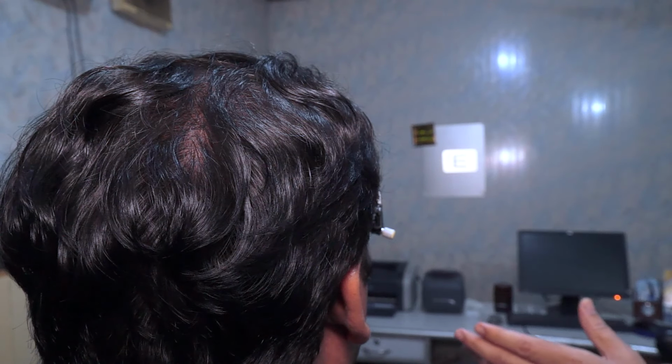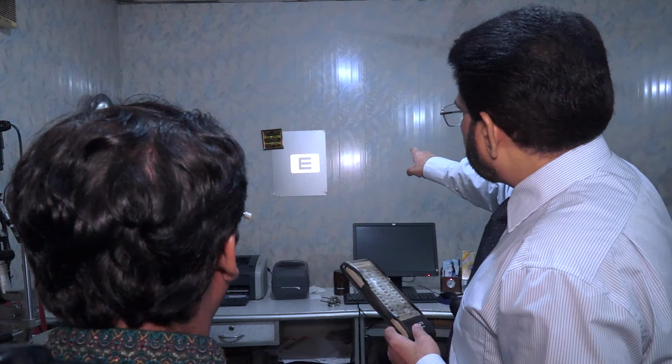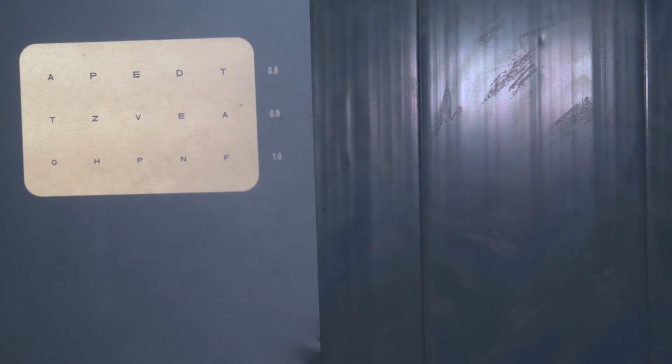Can you read what it is? Yes, it's clear. Okay, now can you read the bottom line? Yeah, ZBD. Now can you read the bottom line again? Yeah, OFR. Okay, can you read the bottom line please?